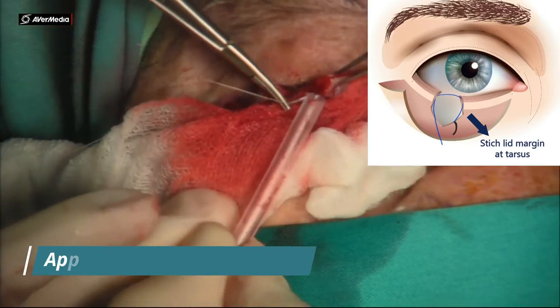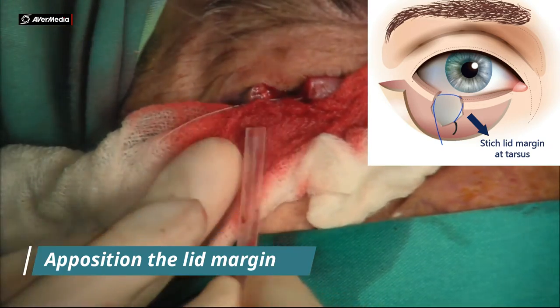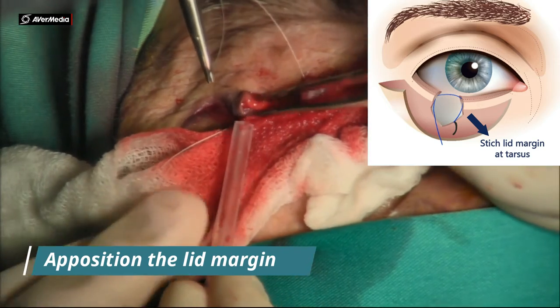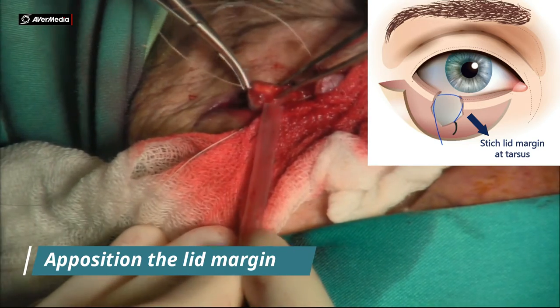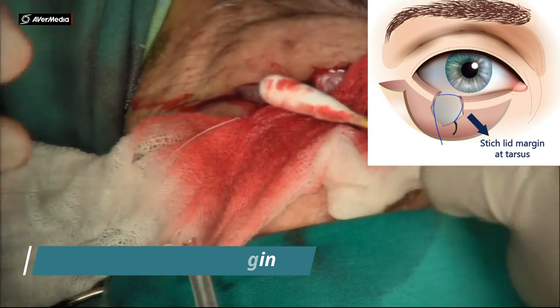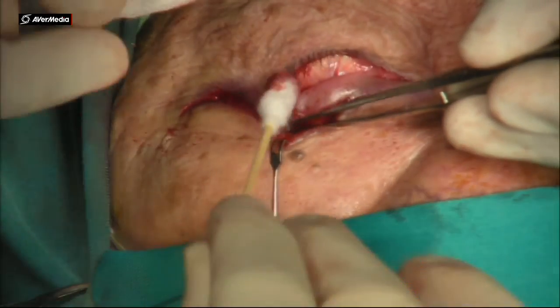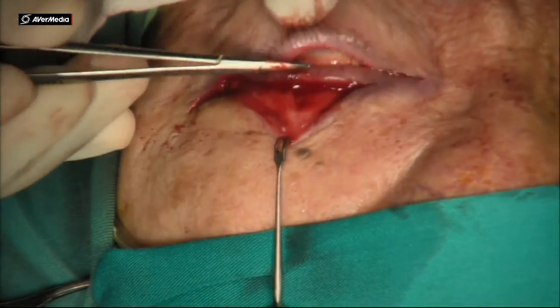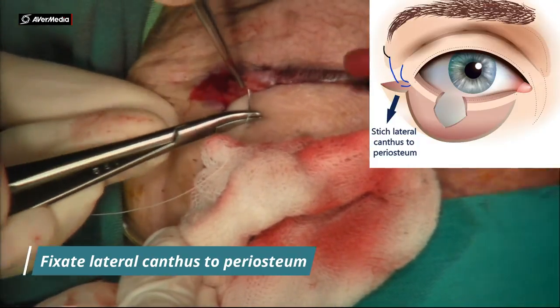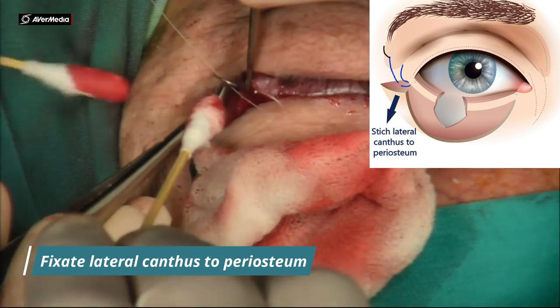We stitched the lid margin at the tarsus to achieve good apposition of the lid margin, using multifilament 6.0 absorbable sutures. Afterwards, we fixated the lateral canthus to the periosteum using multifilament 5.0 absorbable sutures.